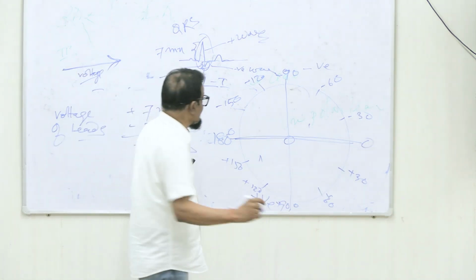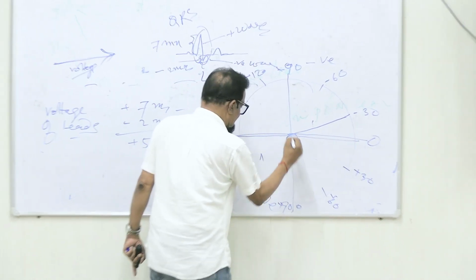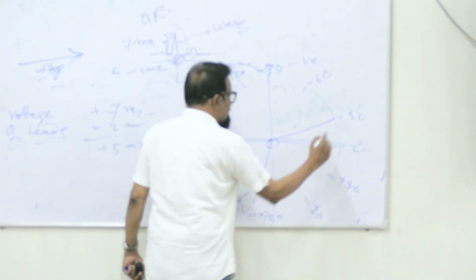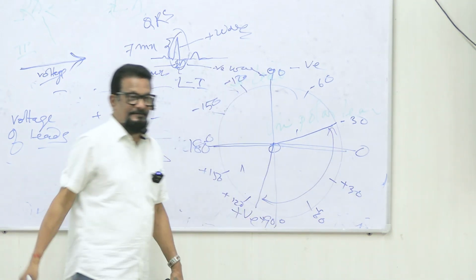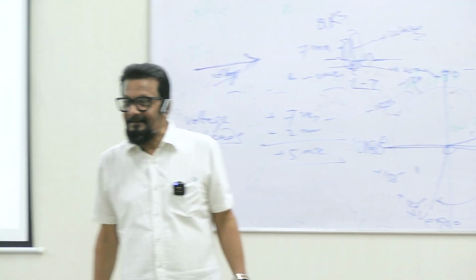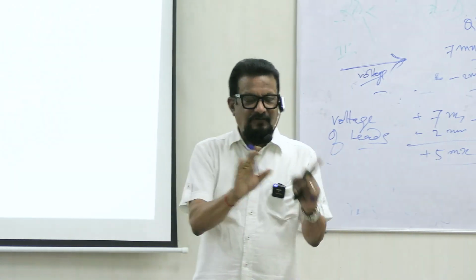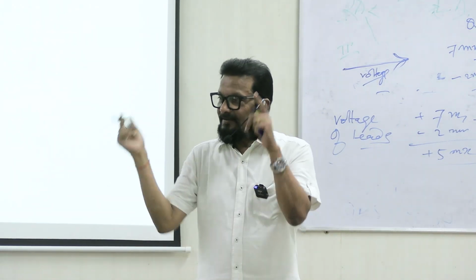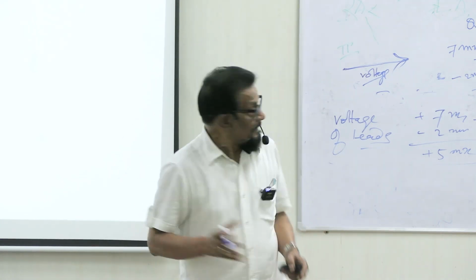If the axis lies between these, this is the normal range. From here to here, this is the normal electrical axis, from minus 30 to plus 110. If we determine your electrical axis and it lies within this range, then your axis is normal.